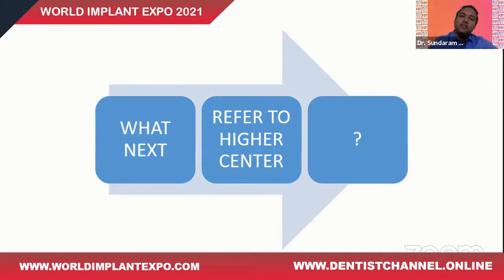So it is only then we go for a higher authority, that is something known as a CT scan.